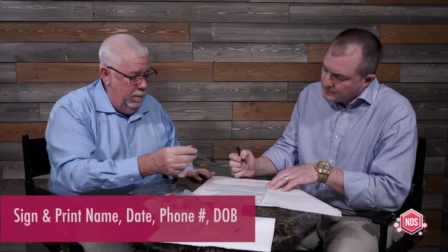I'm going to ask you to sign your name, print your name, today's date, your daytime phone number — include your cell phone, because that's how everybody gets a hold of everybody today. And if you have another number, that's fine, or just write 'same.' Then include your date of birth. This is your certification that this is your specimen. Please print as clearly as possible, because someone at the lab has to data-enter your name, and we hate for them to write 'name illegible' because they couldn't read it.